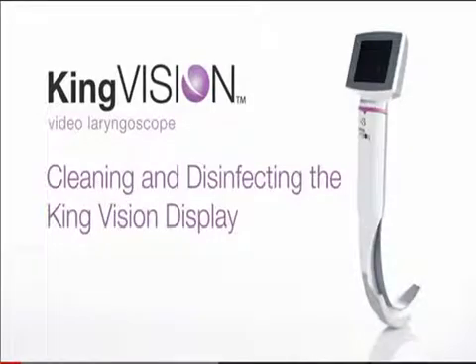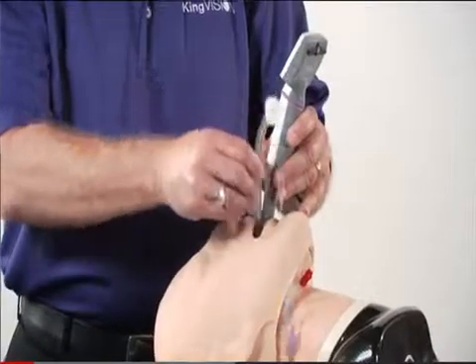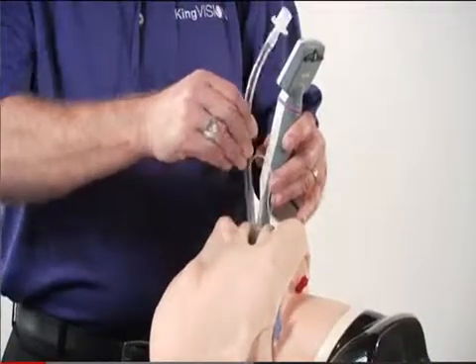In discussing the cleaning and disinfecting of the King Vision, it's obviously important to note that the disposable blade is what is typically contacting the patient, and it's typically what you're holding on to as you're using the device. And as the tracheal tube is positioned, you back it out of the patient. The patient's intubated. You separate the blade from the display. The disposable blade is then actually discarded, and this is the only thing that's reused.